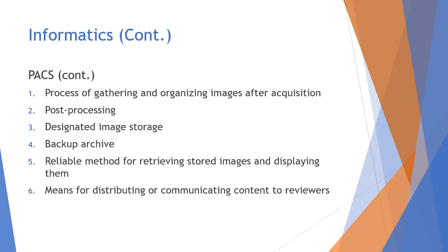So it's all about images. We're talking about organizing images after acquisition, post-processing images, designating image storage, and backup archive of images. We're looking at retrieving stored images and displaying them, and also distributing or communicating content of images to reviewers.